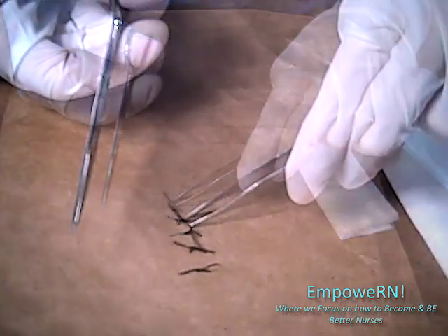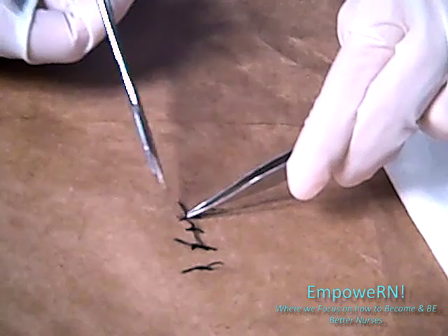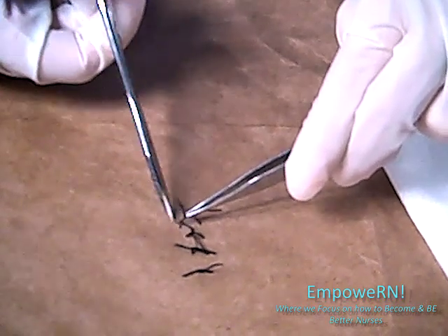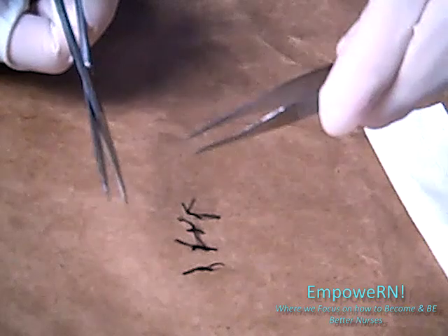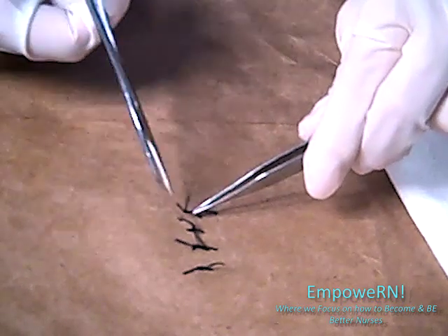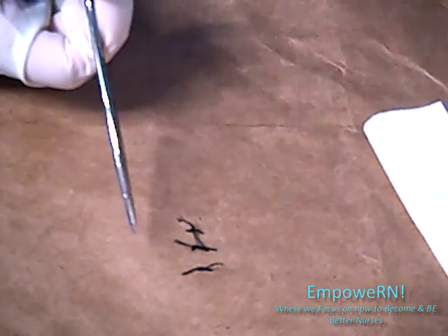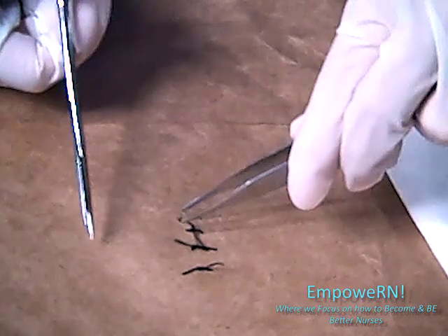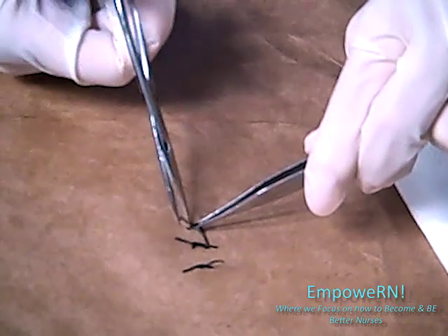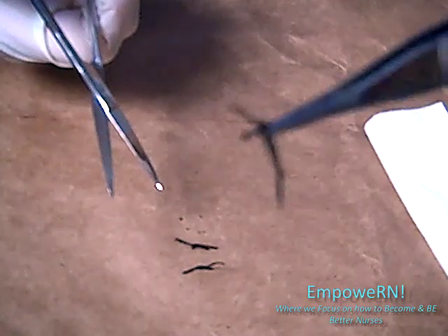Then what you're going to do is pull up, and then cut, and then pull it out. Make sure that the side you're pulling out is the one without the knot — just like that. So there's one. And we're going to pull up and come up again, just like that.